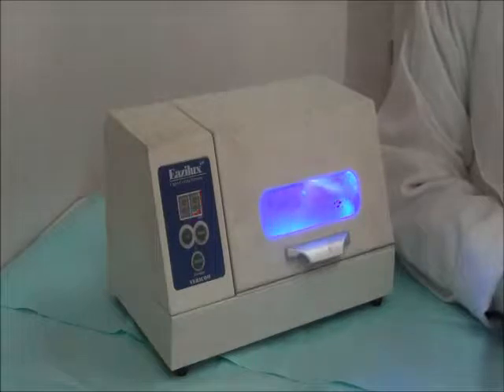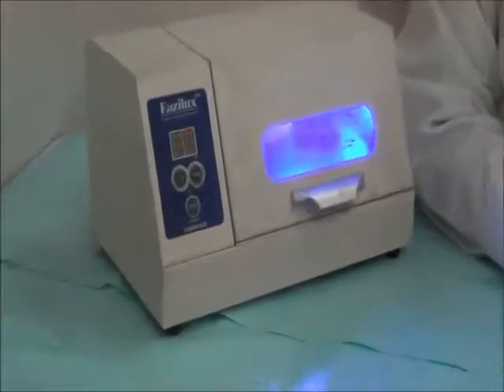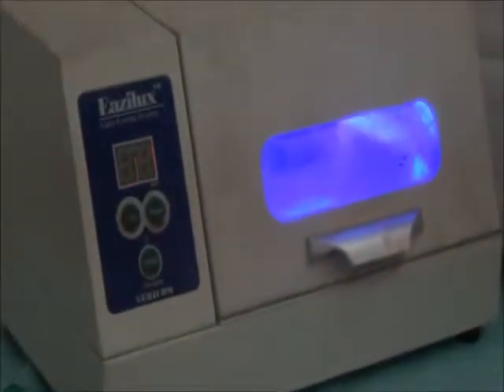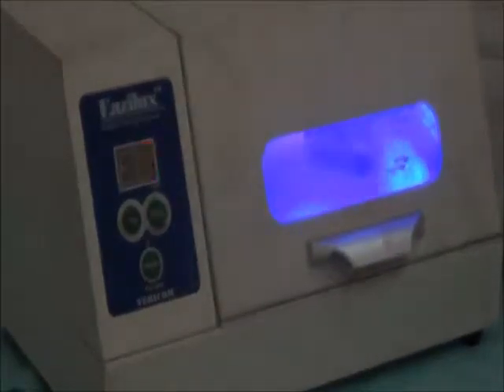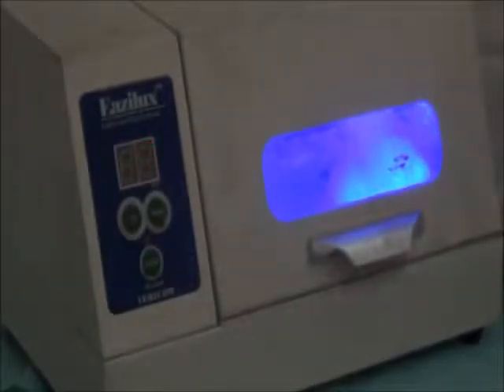This will expose more parts of the tray to the light all around. But even with this rotation, sometimes parts of the tray do not become solid. After the first light curing cycle, we need to take out the tray from the cast and expose the fitting surface of the tray to the light as well.